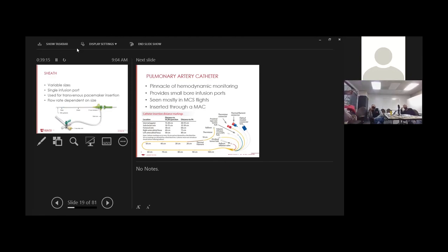Is there any identifiable trait that centers use, like labeling it? They should, but they don't. They should be transduced on the monitor if they're arterial. Ideally, if they're venous, okay, but you can't ever count on it. So you want to start by asking whoever seems to be the most involved with this patient's care and history, be it the nurse or the doc. First you ask, and then you double check. You ask, and then you confirm.